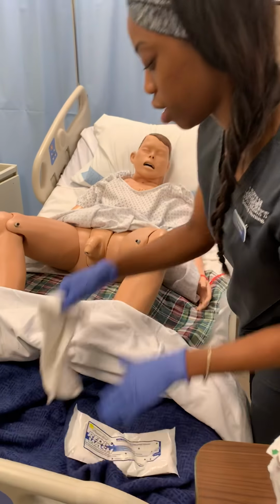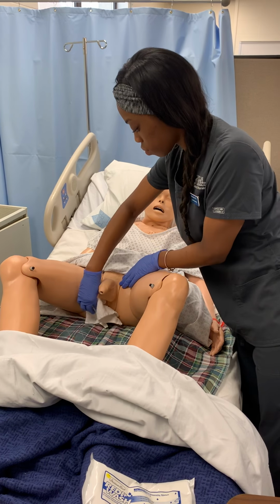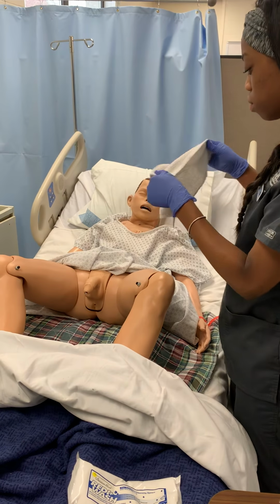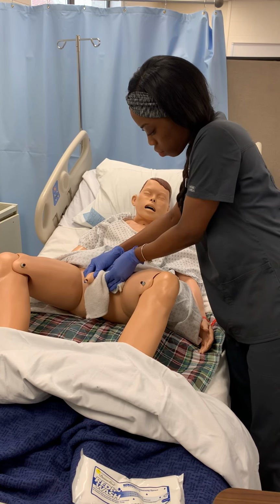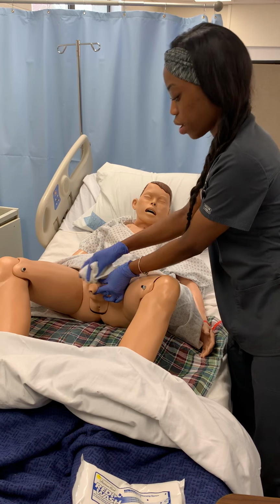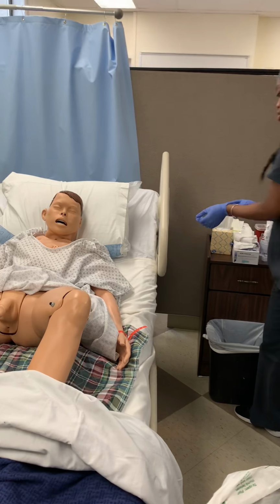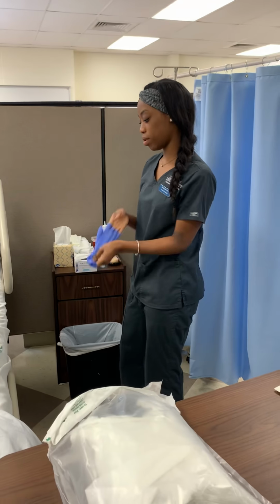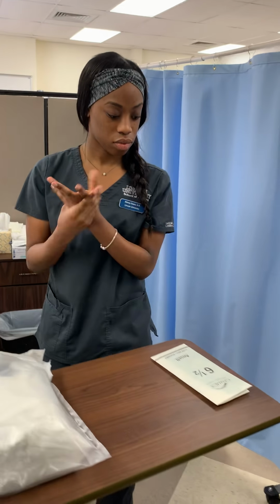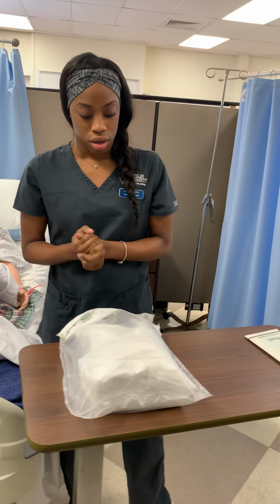Next, I'm going to dry the area. Okay, perineal care is complete. Now I will remove my gloves and set up my sterile field. Make sure all this is dry.